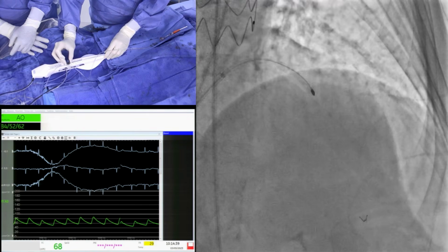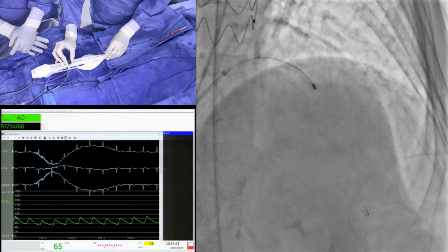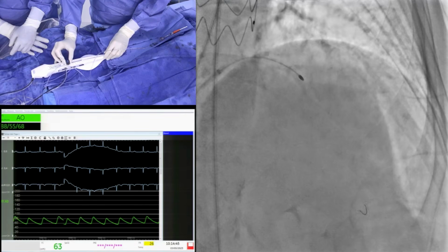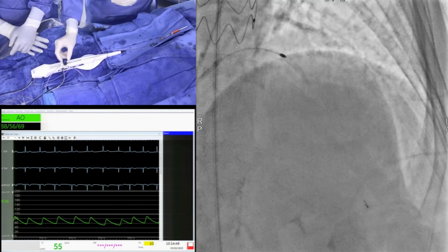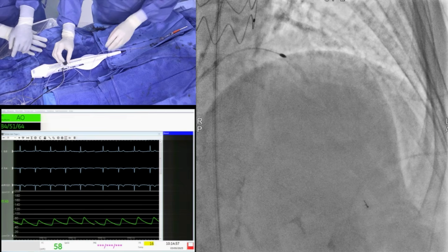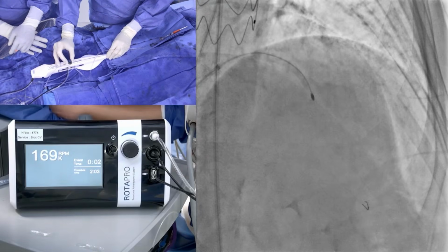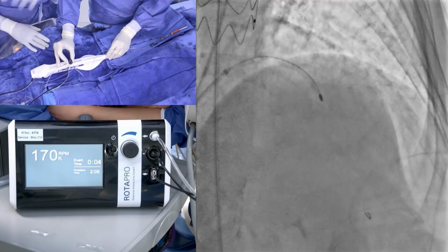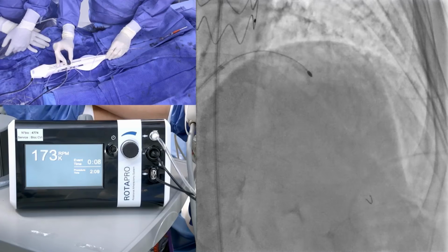So let's go. Do you feel more resistance now as compared to the first one, even in that area? Yeah, even in this area, much more resistance in the feeling. So the burr is working. Okay. We could see that small jump when the burr passed the distal lesion.